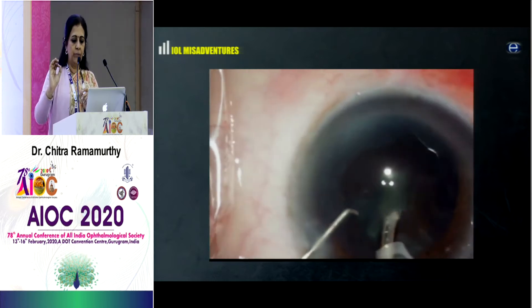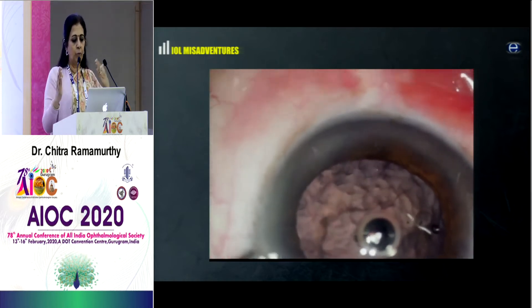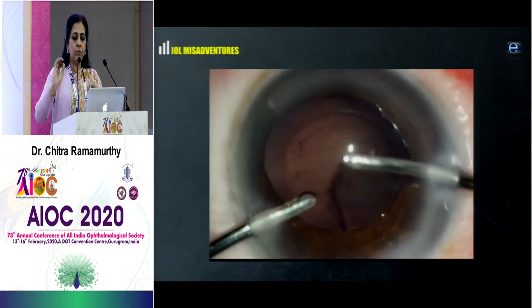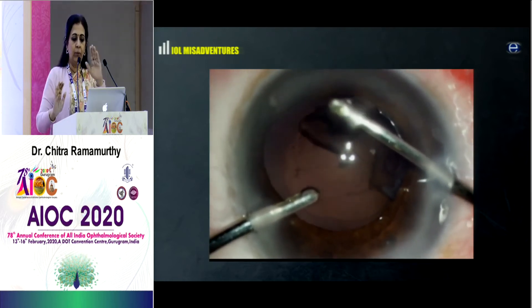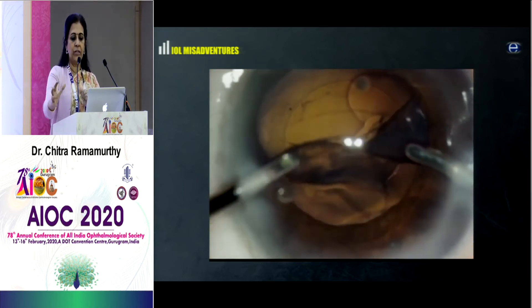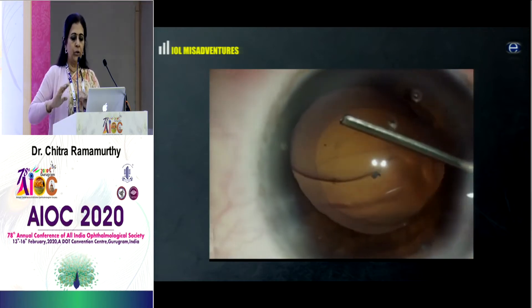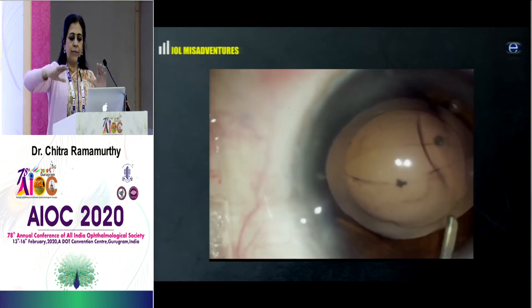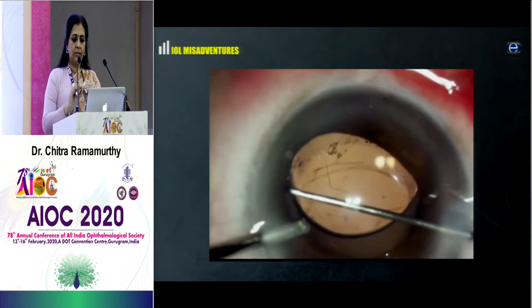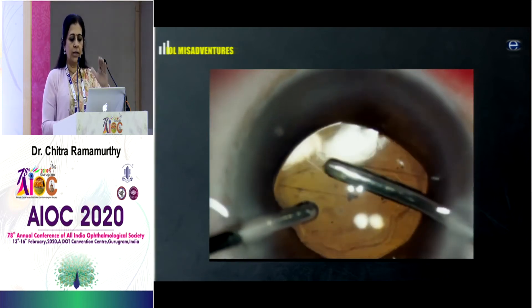I've done everything by the textbook, but then there is a PCR — this was probably a pre-existing PCR. I do not remove my phaco probe; I inject viscoelastic to push the vitreous behind. Without needing vitrectomy, the ease with which I'm able to tease out the cortex gently indicates the vitreous has not come forward. I keep going back and injecting viscoelastic to push any possible vitreous trying to herniate forward. Then I inject viscoelastic in front of the rhexis, balloon up the space between the iris and rhexis, enlarge the incision, insert the three-piece IOL, position the haptics on the sulcus, create an optic capture, remove all viscoelastic, and get out.